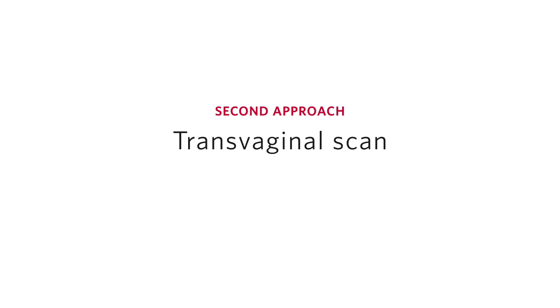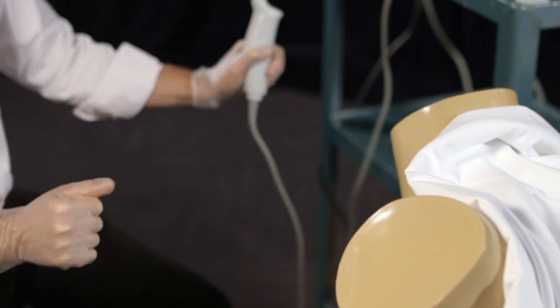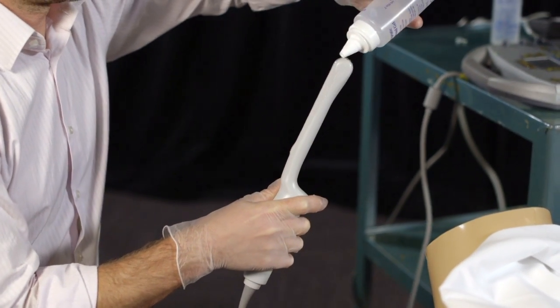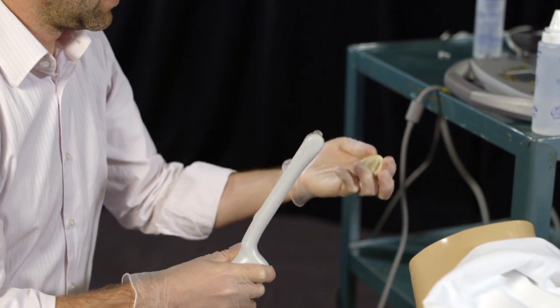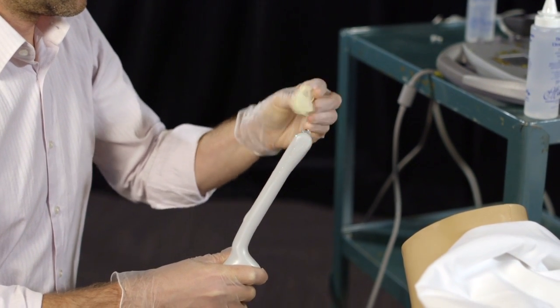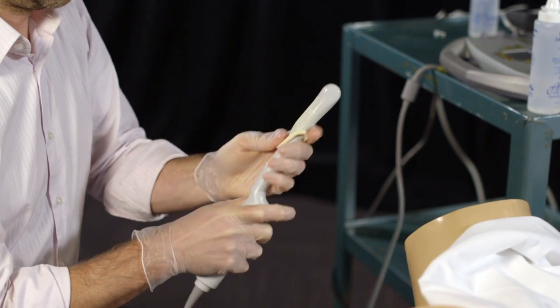If a transabdominal scan is not definitive, switch to the transvaginal approach. For the transvaginal scan, your patient needs an empty bladder. Have the bed set up for a pelvic exam with the patient's buttocks at the edge of the mattress. Prepare the transvaginal probe by first applying ultrasound gel and then the sterile probe cover, and also apply some lubricant gel on the probe cover.